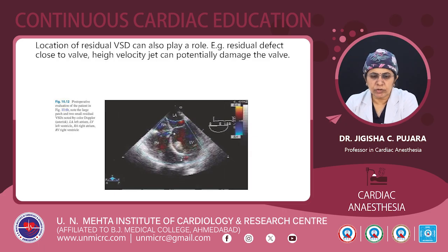Location of the residual VSD can also play a role. Here the image shows a residual defect close to the valve. A high velocity jet can potentially damage the valve, so one should address it. You can see the asterisk and arrow marking the residual VSD.